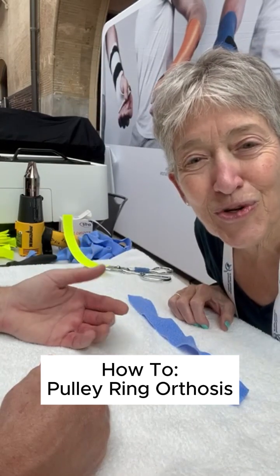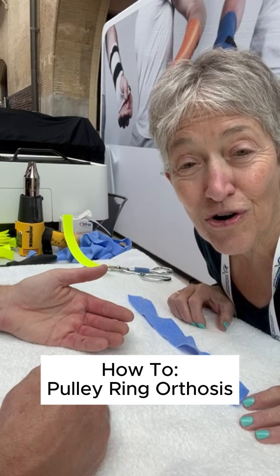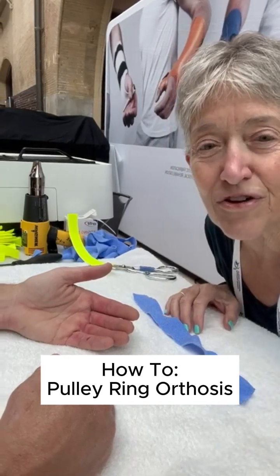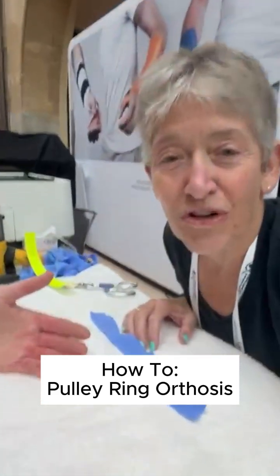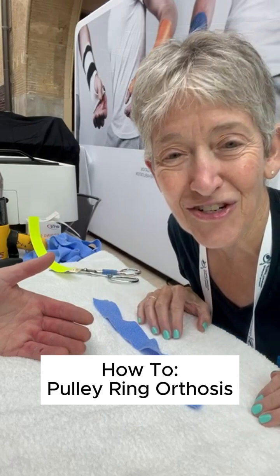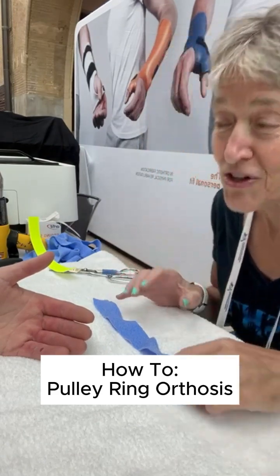Hey hi, I'm Debbie Schwartz. I'm at ASHT 24 in St. Louis and we have here a professional rock climber named Chris, and we're going to make a rock pulley protector for him so he can continue with his rock climbing adventures.